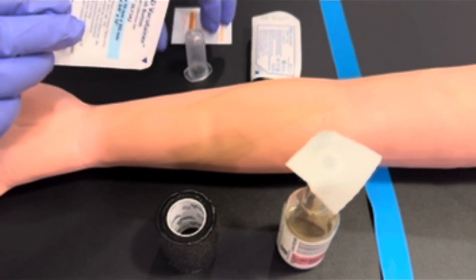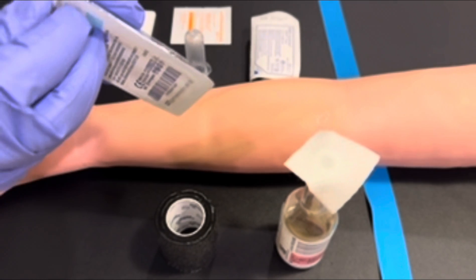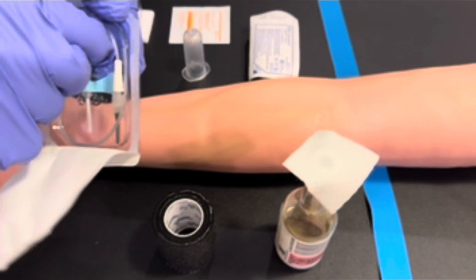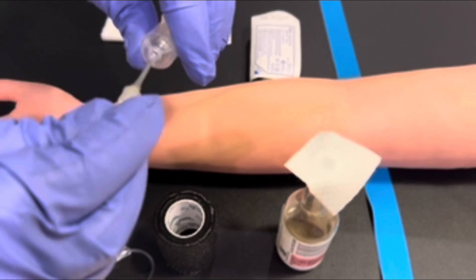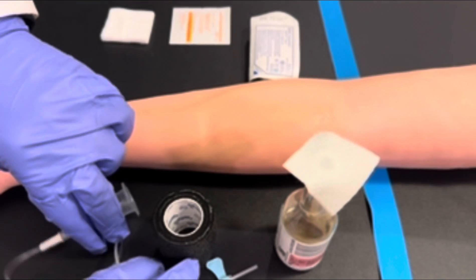Next, you are going to select your butterfly needle device and connect your 23-gauge size butterfly that we're using today and assemble the secondary needle into your vacutainer holder.